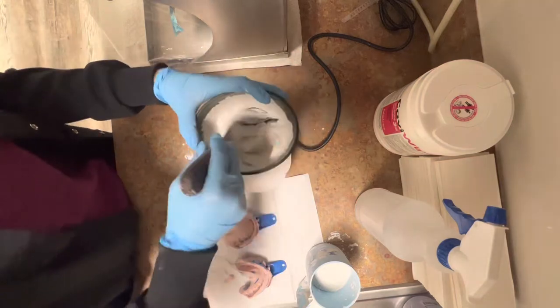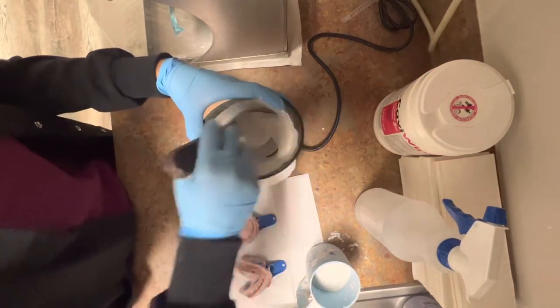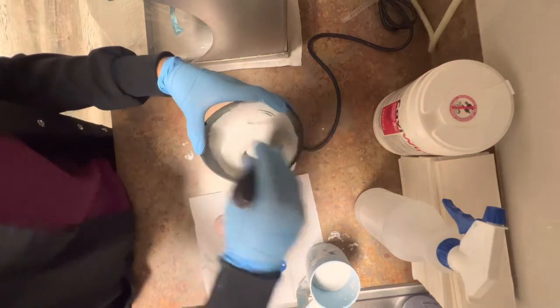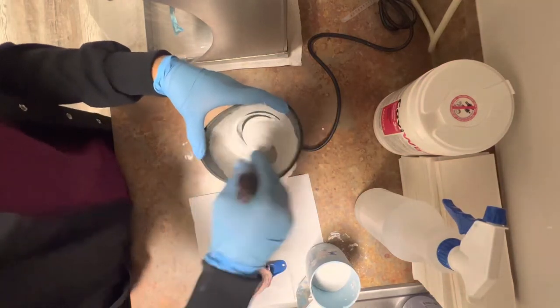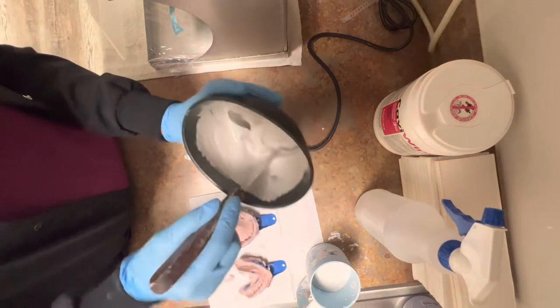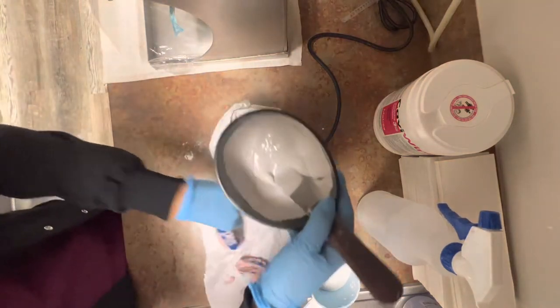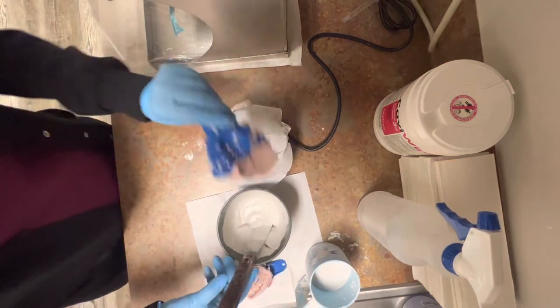If your hands get tired, do not give up. This is a workout — just pretend you're making pancakes. Remember that everybody does this completely different. Everybody has their own technique. This is my technique.